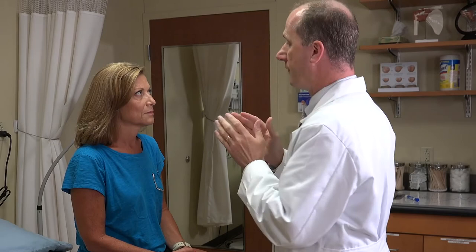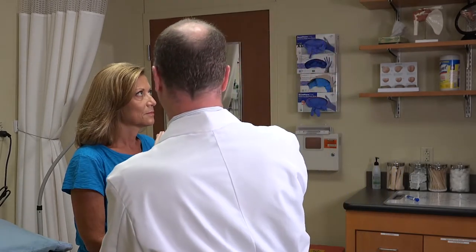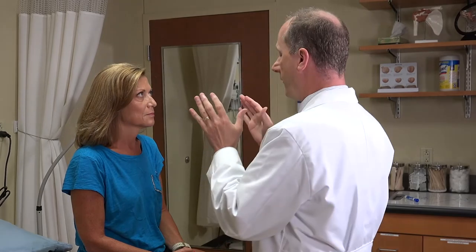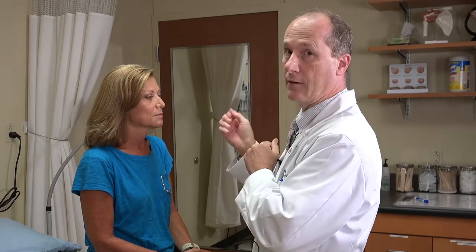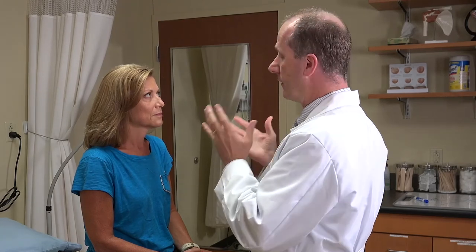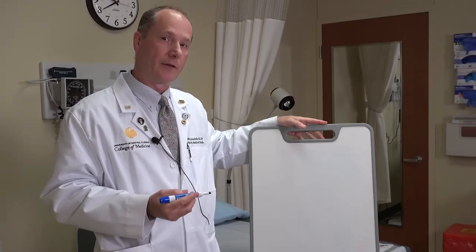This is probably the most crucial point of what you're going to do, because a lot of folks will start over here and end up way too medial or way too lateral. You want to make sure that your eye level is about 20 degrees off and you go straight in to actually see the patient's optic disc. If you're able to land on or close to the optic disc, it reduces the amount of time you're shining that bright light in the back of the patient's eye, it's more comfortable for the patient, and you'll be able to land on that disc much sooner.